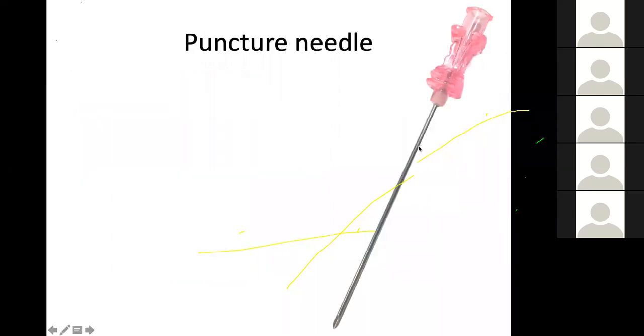This is an angiographic puncture needle, which will be 18 gauge. And its length will be 7 centimeters.